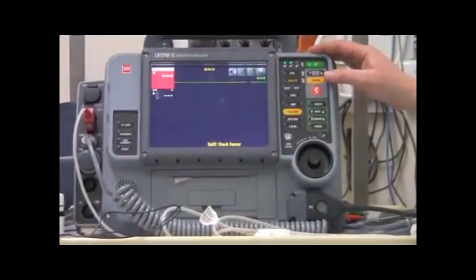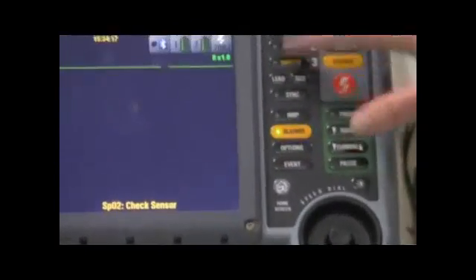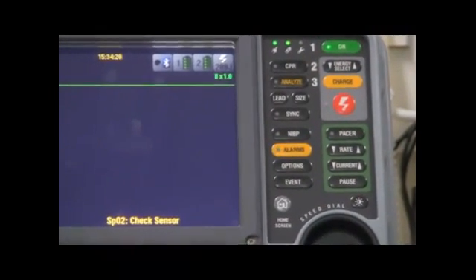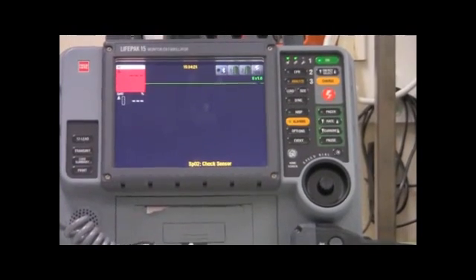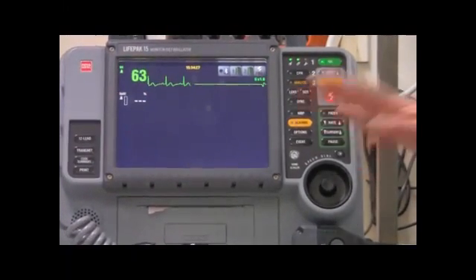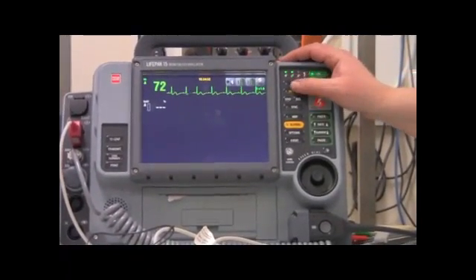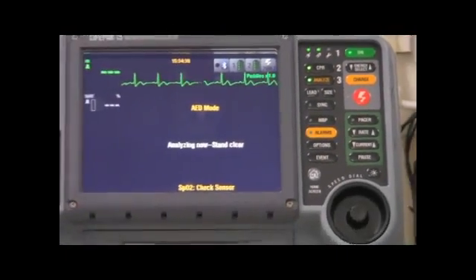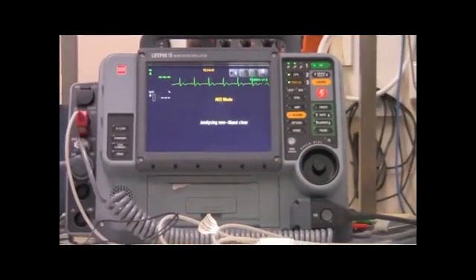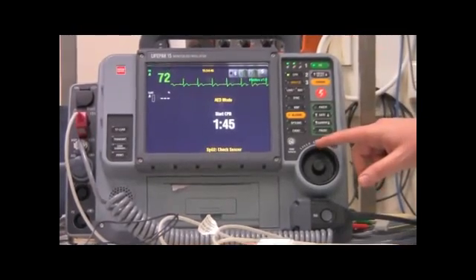Then in terms of semi-automated mode, if you hit analyse, and I might just put it on the simulator so that you can see. So we've applied the paddles to the patient and we've got a rhythm, and now we can tell the machine to analyse the rhythm. This is semi-automated mode, so you press analyse. Analysing now. Stand clear. No shock advised. Start CPR.